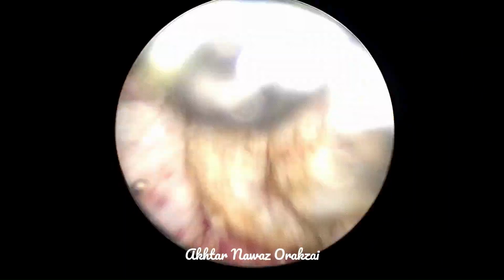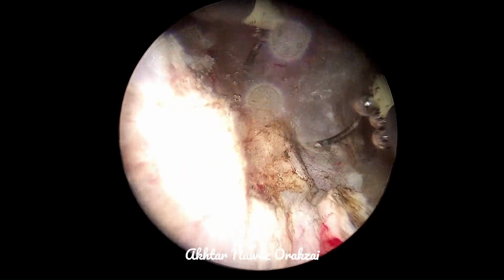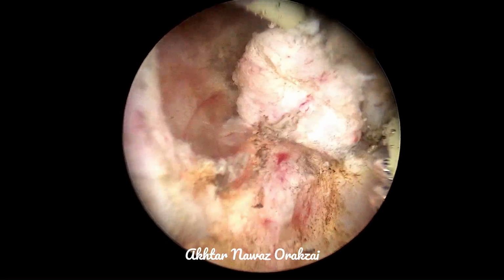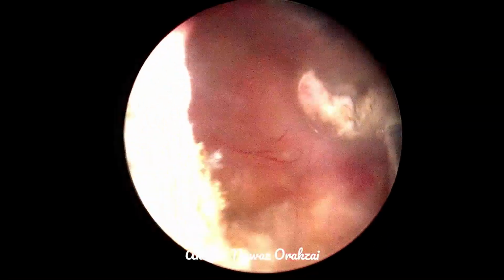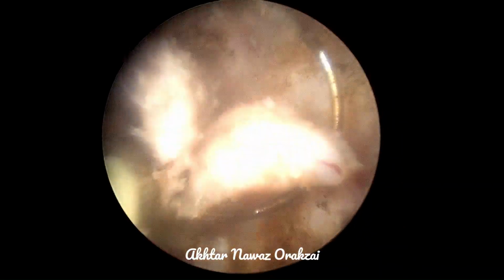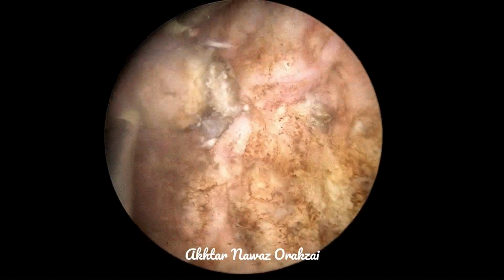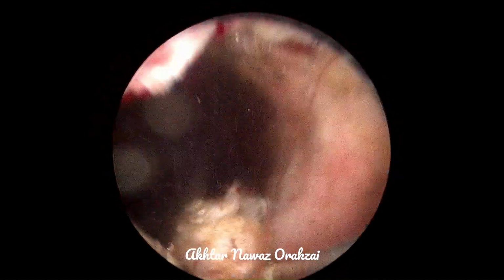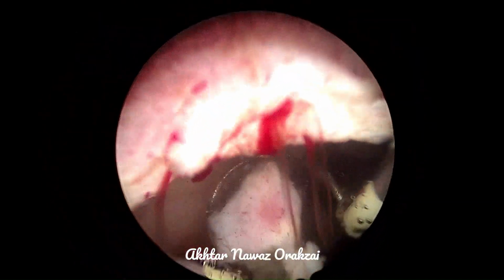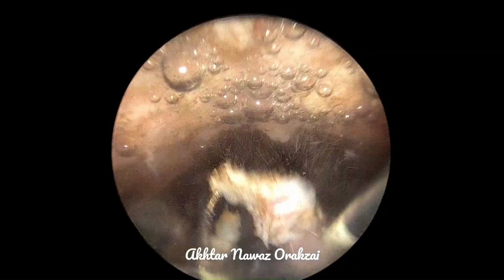Completeness of the procedure can only be assessed after emptying the bladder 2 or 3 times after the procedure. The most common mistake by the beginner is that continuous resection is performed, the bladder is filled and the prostatic cavity is stretched because of the inflow of the fluid, and the beginner thinks that a good channel is made.